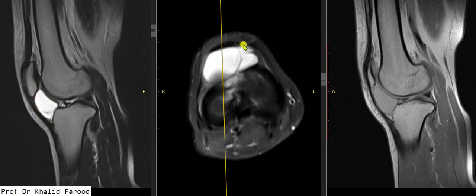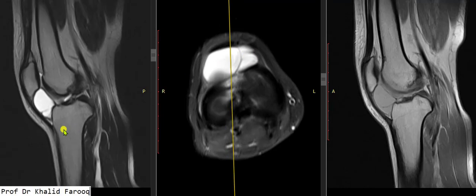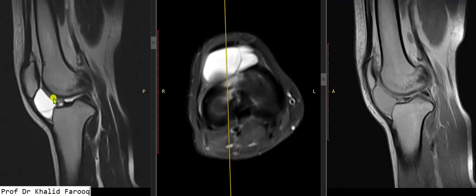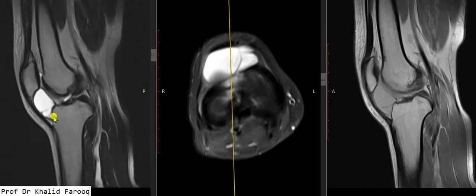This is the area of the infrapatellar Hoffa's fat pad, and this area contains a cystic lesion which is well-defined and contains multiple septa within it. We can see the septa in this cyst, which is located at the infrapatellar Hoffa's fat pad. This is a very rare case of a ganglion cyst of the infrapatellar Hoffa's fat pad.